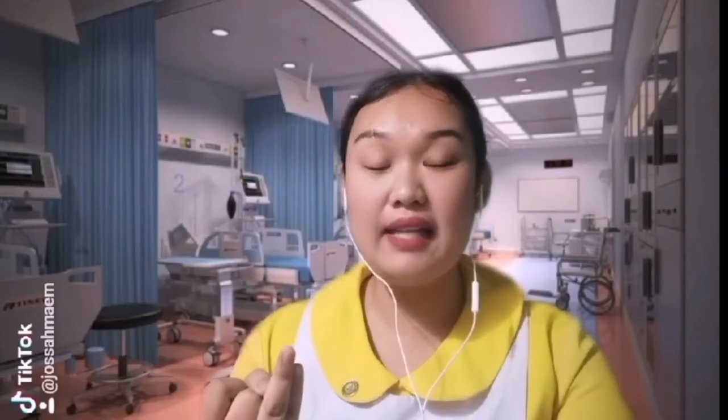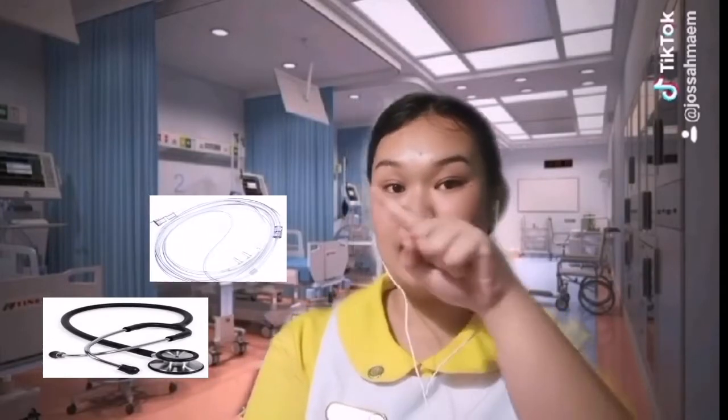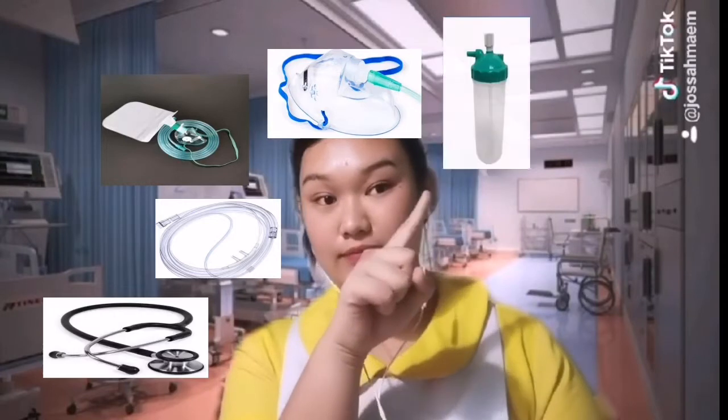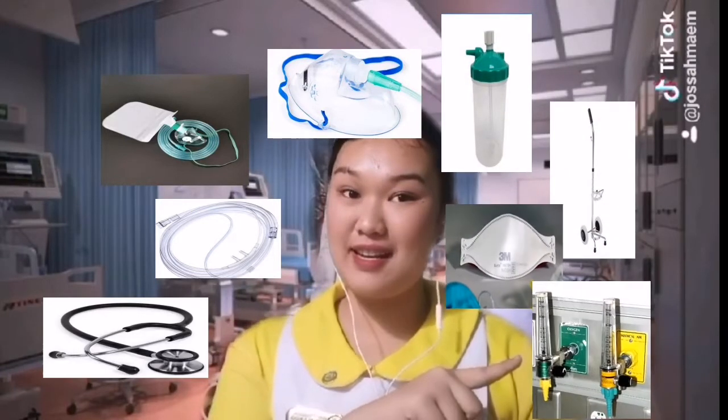Now, for the nursing assessment, first you have to assess the client's level of consciousness, level of understanding and knowledge. Second, you have to assess the client's vital signs. Third, you have to assess the client's breath sounds and any signs and symptoms of respiratory distress. And last, you also need to assess the availability and functionality of the needed materials. You will be needing this one, and also this one, this, and the last one.